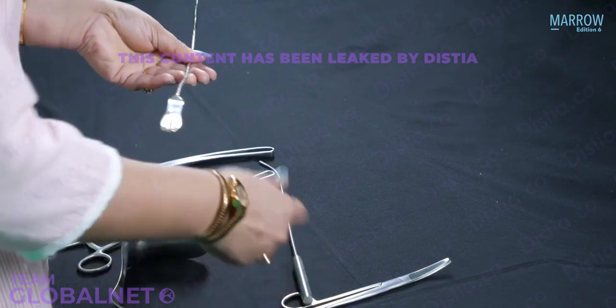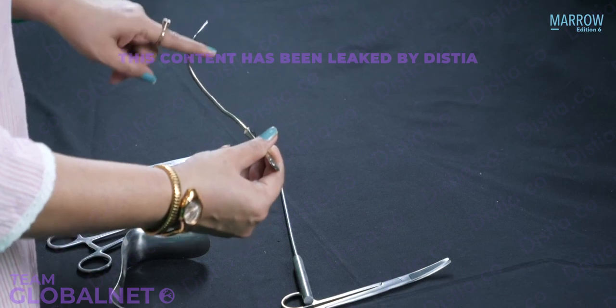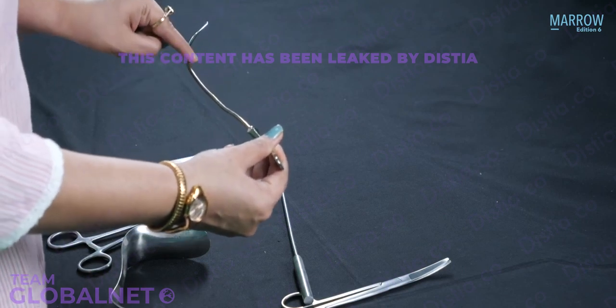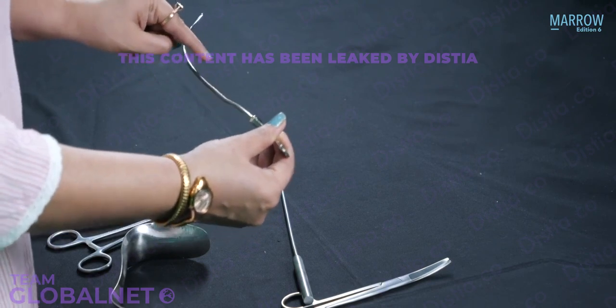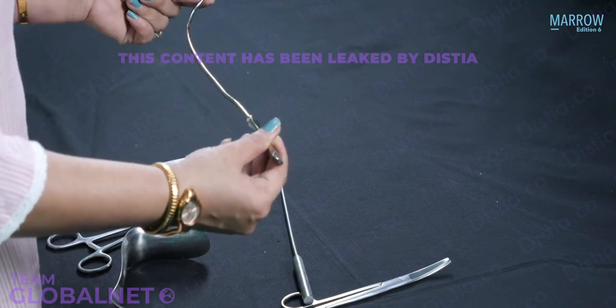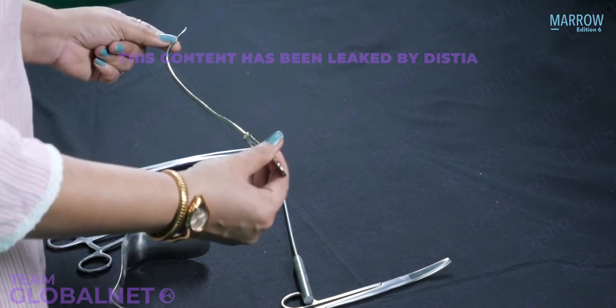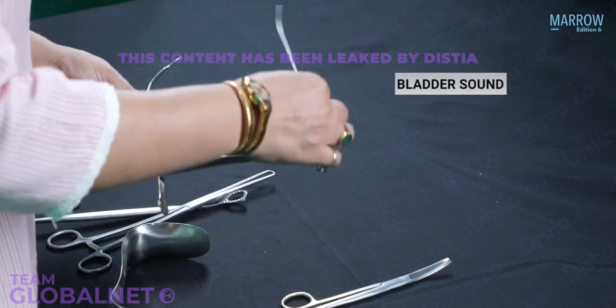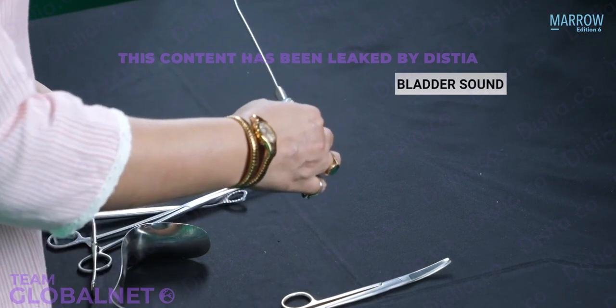So I'm just showing the uterine sound to you so that you can appreciate its angle. Yes, you can appreciate the markings. It is calibrated. When you hold it in your hands, you will see calibrations are present and it will have an olive tip, right? So this in my hand is a uterine sound, whereas this now in my hand is a bladder sound, right?